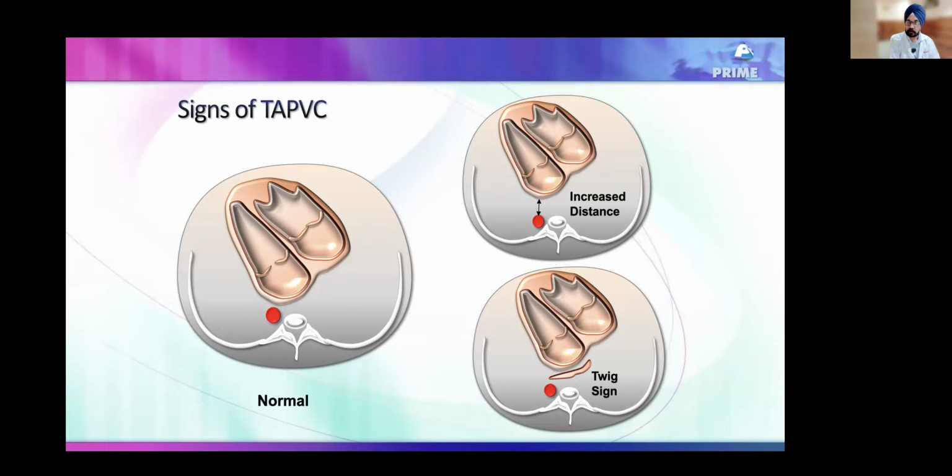How do you recognize this is a posterior chamber? There is a membrane separating the LA and the posterior chamber. If you do not see that membrane, particularly once you put on the color Doppler and you do not have side-by-side 2D, the color information coming from the pulmonary vein would possibly spill over on that structure and would be masked.